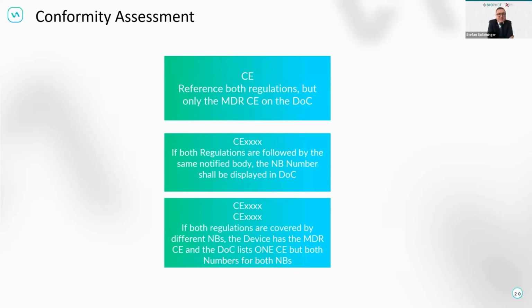These don't allow that. There are currently potential pathways to allow this kind of possibility in both pathways, so that there is one particular additional CE mark or CE mark by one notified body overriding the other one, but that's in the system not really possible. And right now, the MDR and IVDR do not accept this. So both regulations would need to have 2 additional conformity assessment procedures, and that will then follow up and lead to certain friction in your certification as well as your product registration.